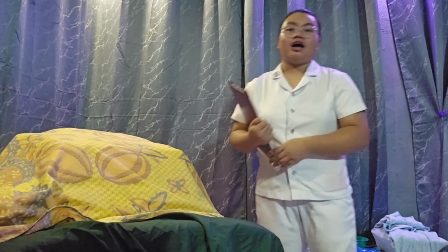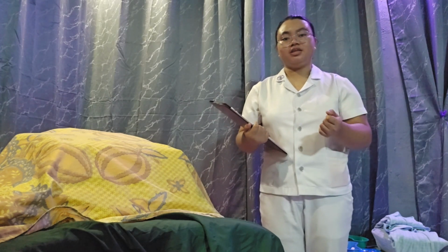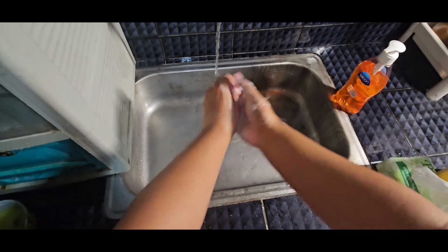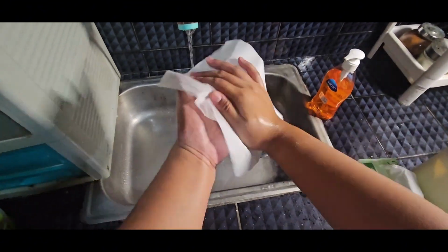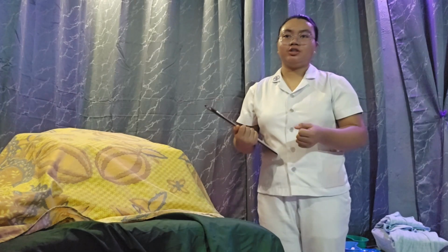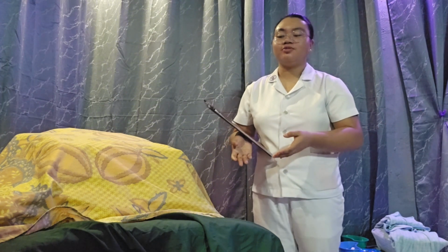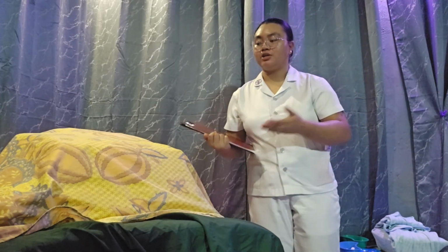Okay po. So after explaining the procedure, we are now going to perform hand washing to prevent the spread of microorganisms. So after performing hand washing, we are now going to provide the patient's privacy by closing the door of the patient's room to make the patient feel comfortable, as well as to maintain the patient's dignity. So ma'am, I'm just going to close the door po, okay?